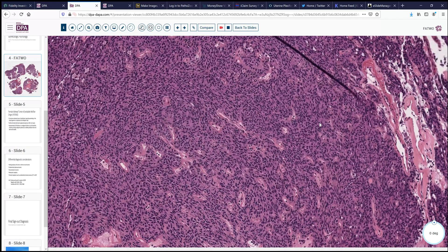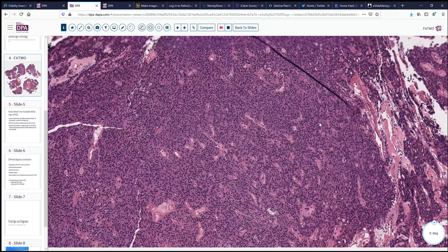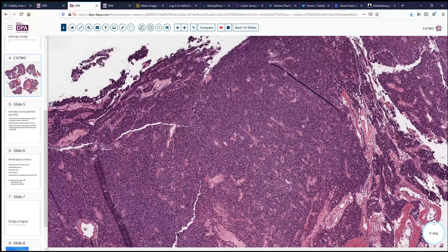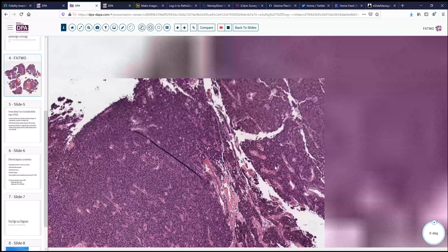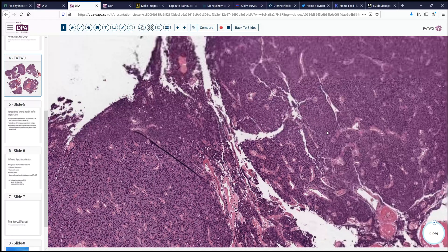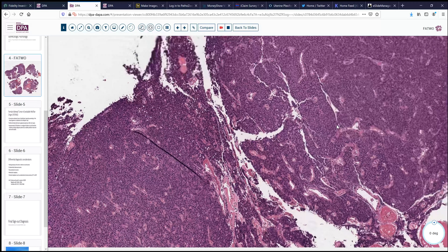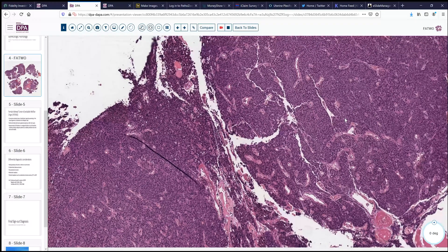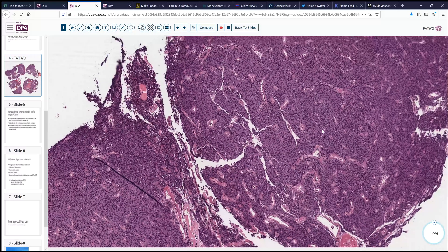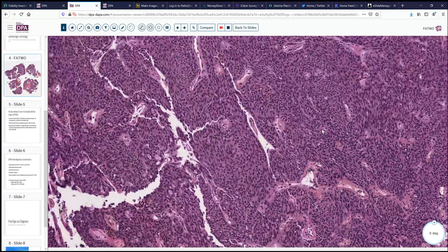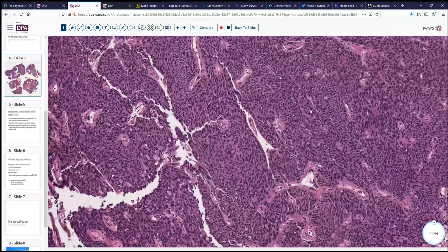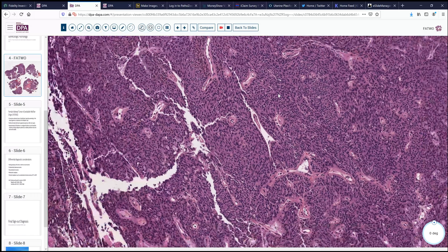Immunohistochemistry was performed to provide some help in defining this lesion. One of the most important markers was inhibin, which was entirely negative. And so that, together with other markers, tended to argue against this being any sort of a sex cord stromal tumor, such as a granulosa cell tumor or other type of sex cord tumor.